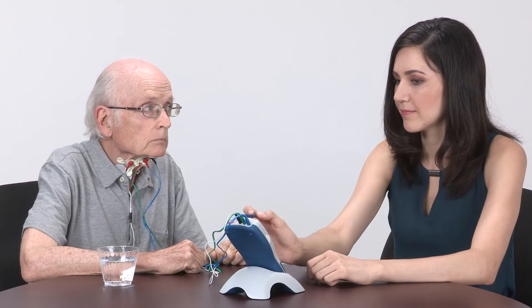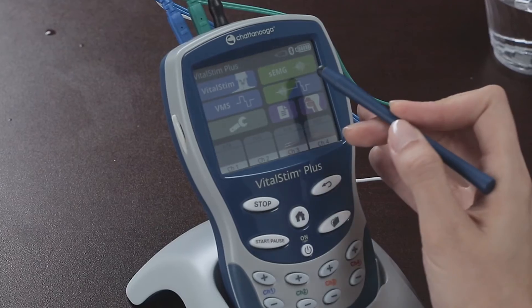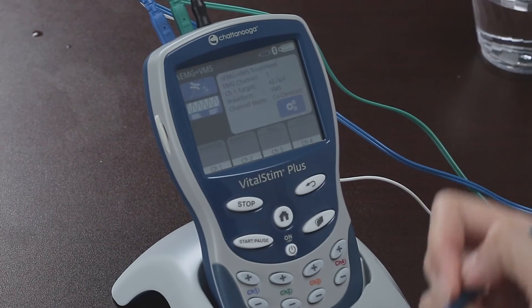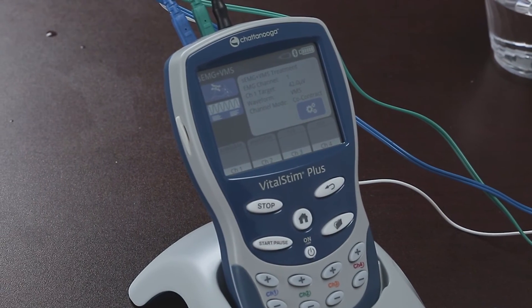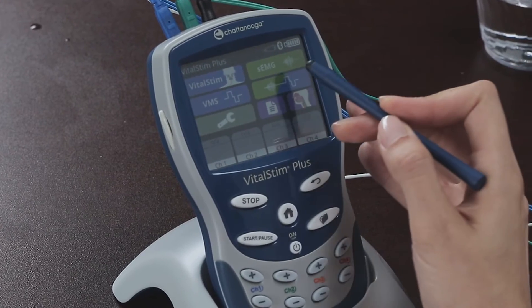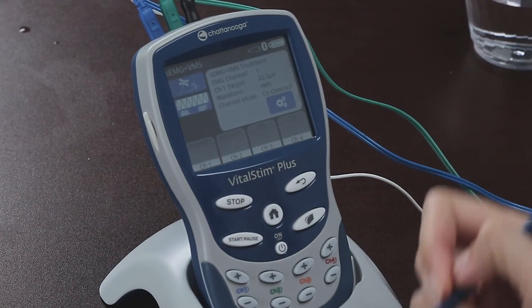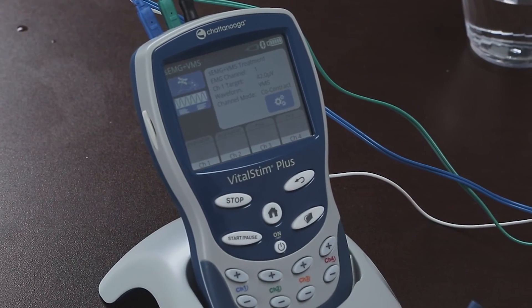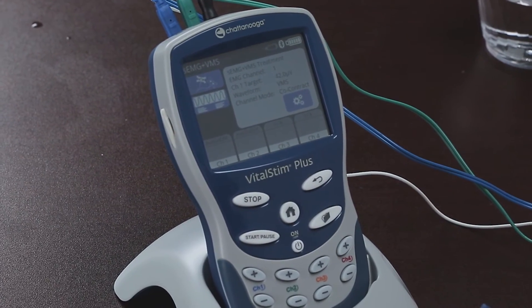Pressing EMG Triggered Stim from the home screen will get us into EMG Triggered Stim mode. In this mode, the patient is encouraged to work like before, but when they reach the threshold, the stimulation will kick in as a reinforcement of the effort. Pressing EMG Triggered Stim brings us to the point where we can set the parameters for both the stim and EMG.